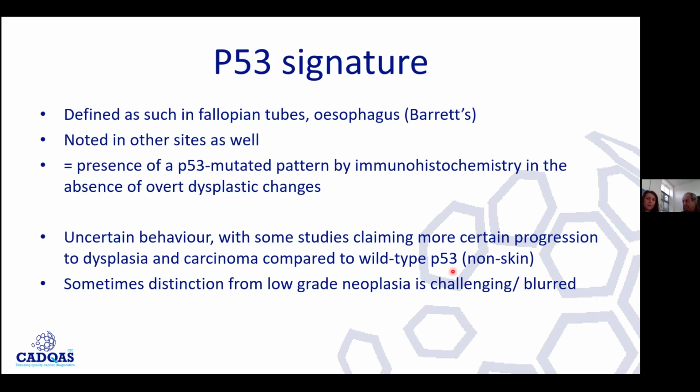And this is a bit tricky because, for instance, in the esophagus, you might have a case for second opinion from a pathologist who did P53, and you would look at the morphology and say, well, actually, it's not dysplasia, is it? And then you will need to interpret it. But the P53 could be mutated. Retrospectively, yeah. And then, okay, can I say something?